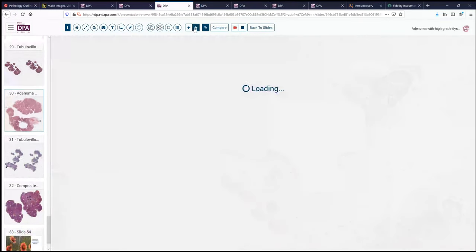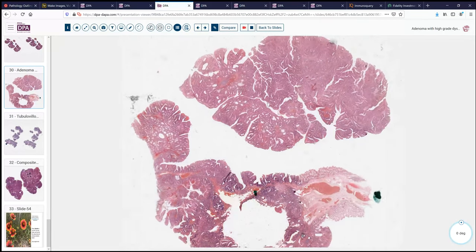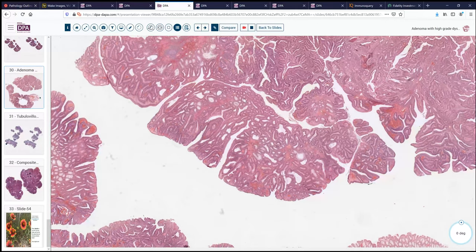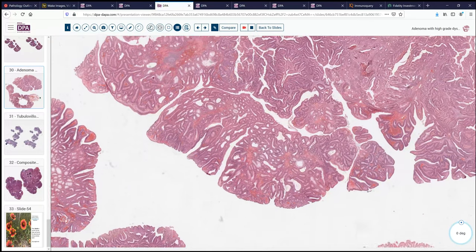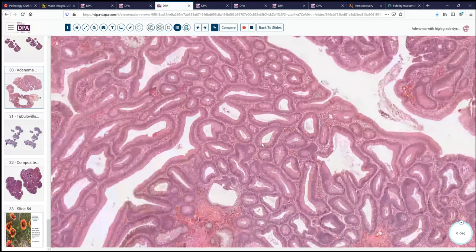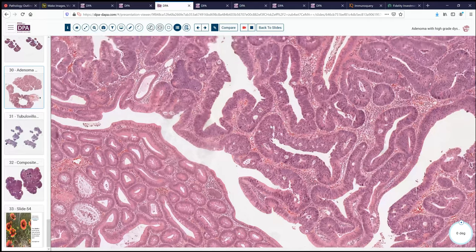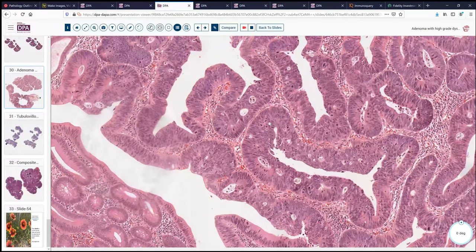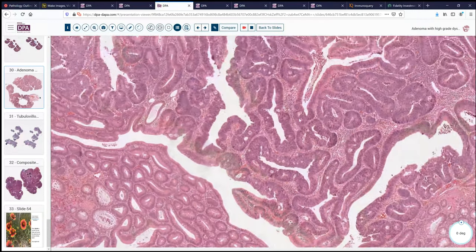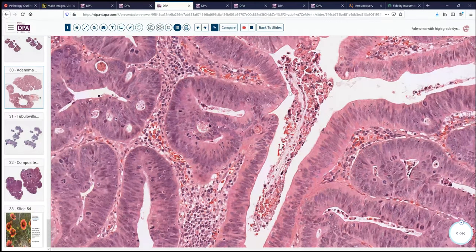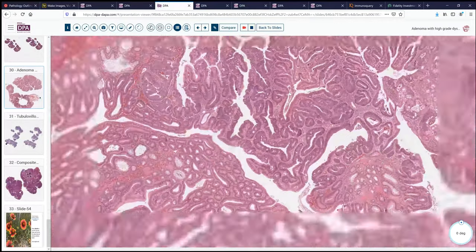Here's another sort of more tubulovillous-type lesion with some glandular structures and villous changes. At intermediate power, you can see the difference between this cytology and what's over here. Going at higher magnification to compare: here's our low-grade dysplasia, here's our high-grade dysplasia. Seen back to back, it's fairly easy to identify. We begin to see the cribriform-type change, individual cell necrosis, karyorrhectic debris, luminal contents with dirty inflammatory diathesis. Those are all very helpful features in defining high-grade dysplasia.